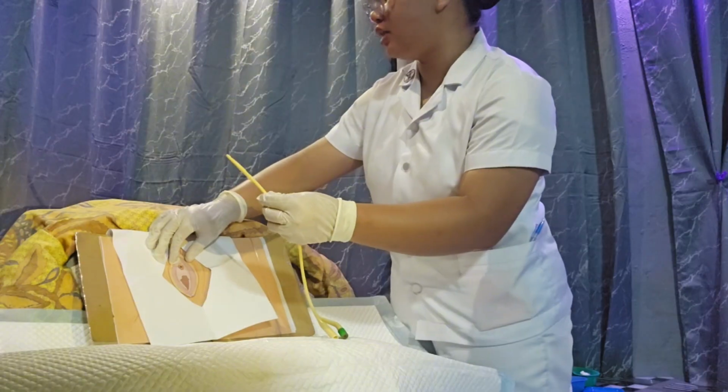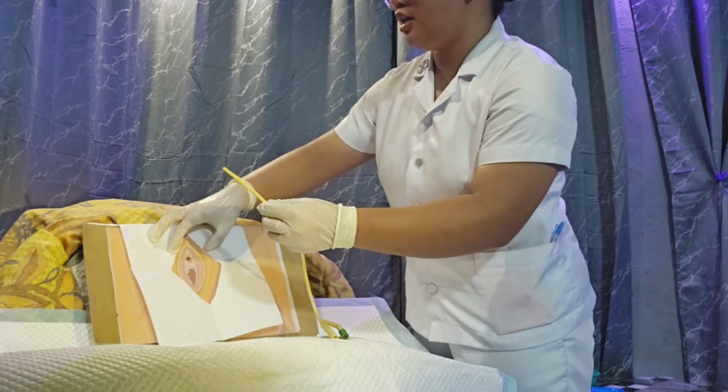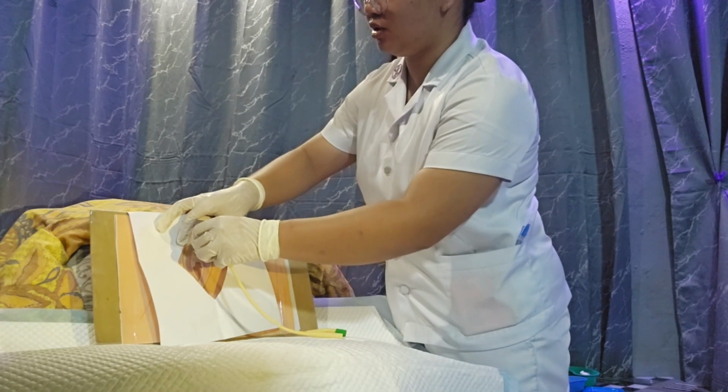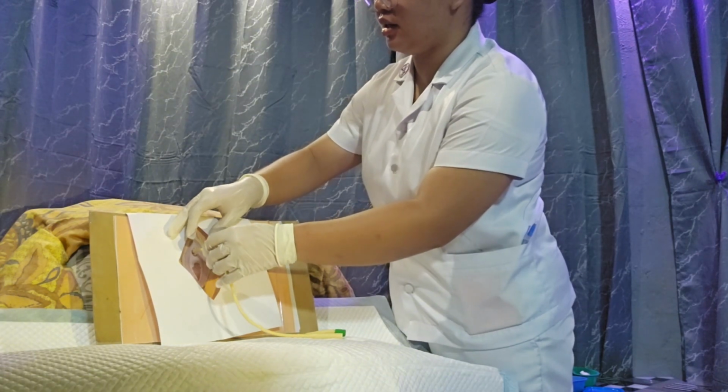Okay, ma'am, so I am going to insert now the catheter po. So inhale and exhale. Okay, ma'am, it's painful po, right? So relax lang po kayo. The pain will go away naman po.